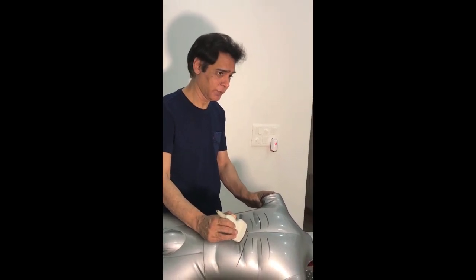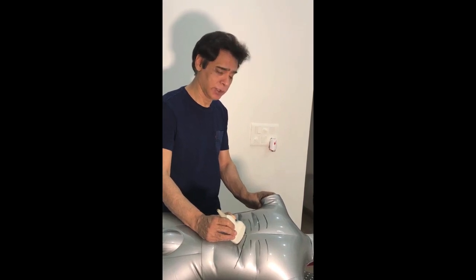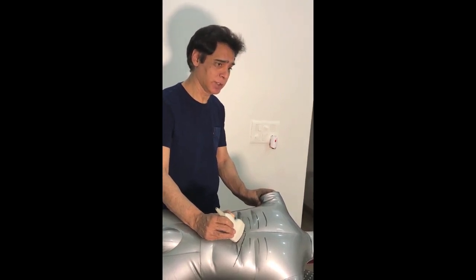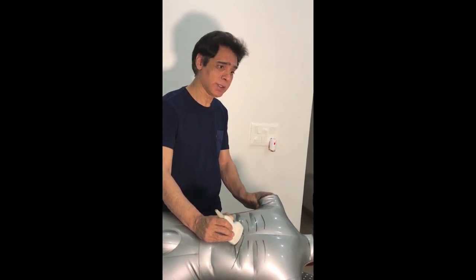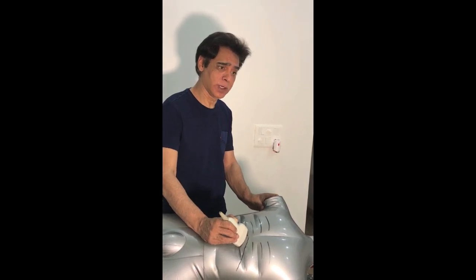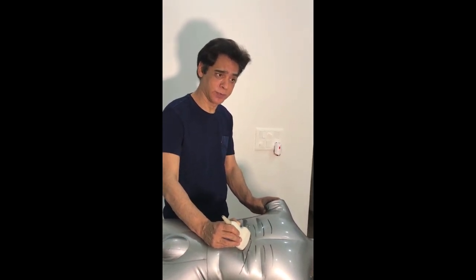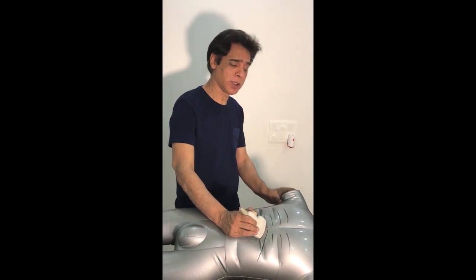Now, as we move toward this distal end, you can make out in the picture that the distal part of the CBD can be seen. As it is moving distally, CBD will be seen to cross the portal vein from anterior to the posterior side, and you can very well make out the crossing, and then CBD passes through the head of the pancreas before ending into the second part of duodenum.